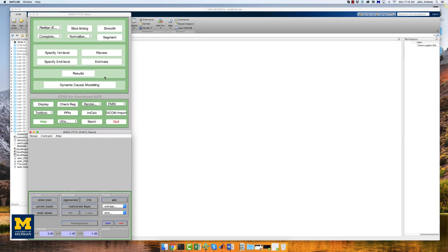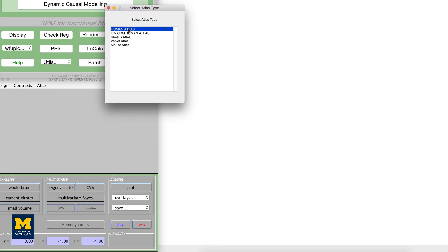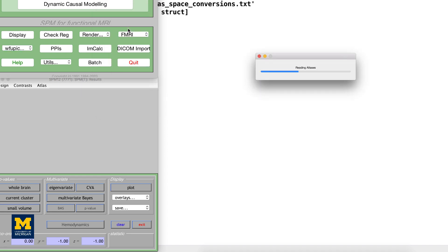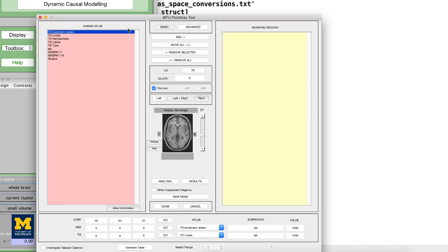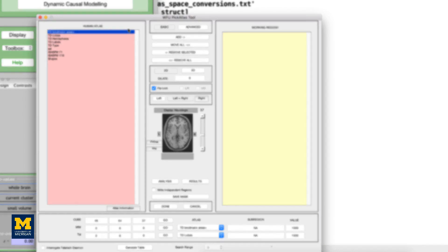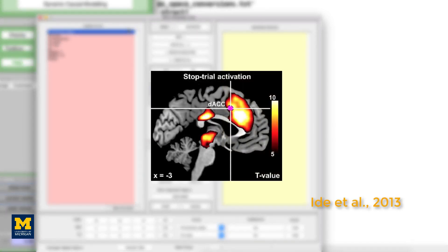Let's begin by opening the WFU PIC atlas toolbox you installed in the last video. The Human Atlas option will open an atlas of Brodmann areas, cortical parcellations based on tissue structure and cell organization. From previous studies of cognitive control, we would expect our study to show significant activity in the dorsal anterior cingulate, or DACC, region, roughly corresponding to Brodmann area 32.